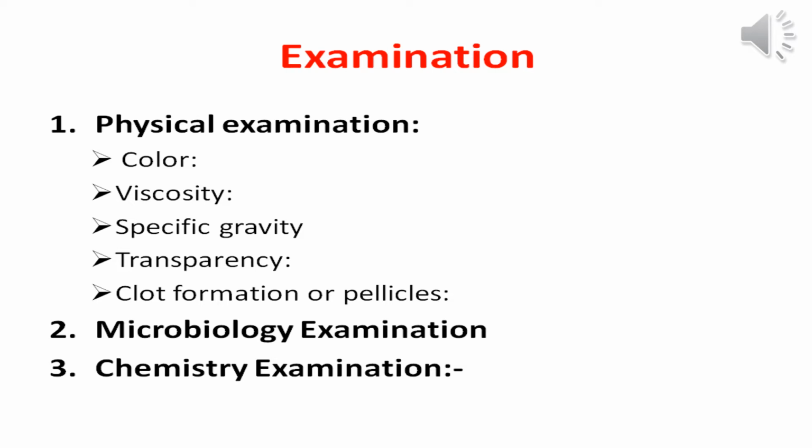Now in the microbiology lab, what did we say? The most important thing is to start with the culturing of the sample. Sometimes if the causative agent is Mycobacterium tuberculosis, in this case we need to add Lowenstein-Jensen agar media to the primary plate to culture it. After culturing we need to perform acid fast stain.